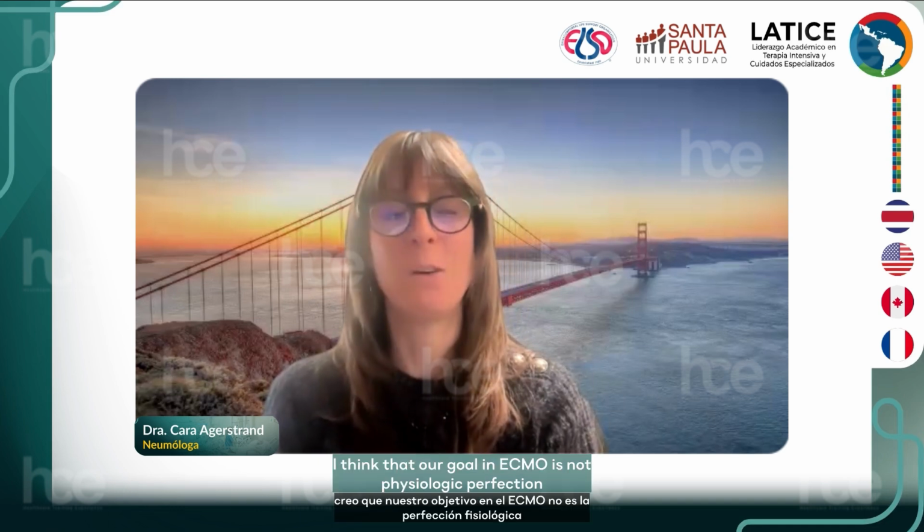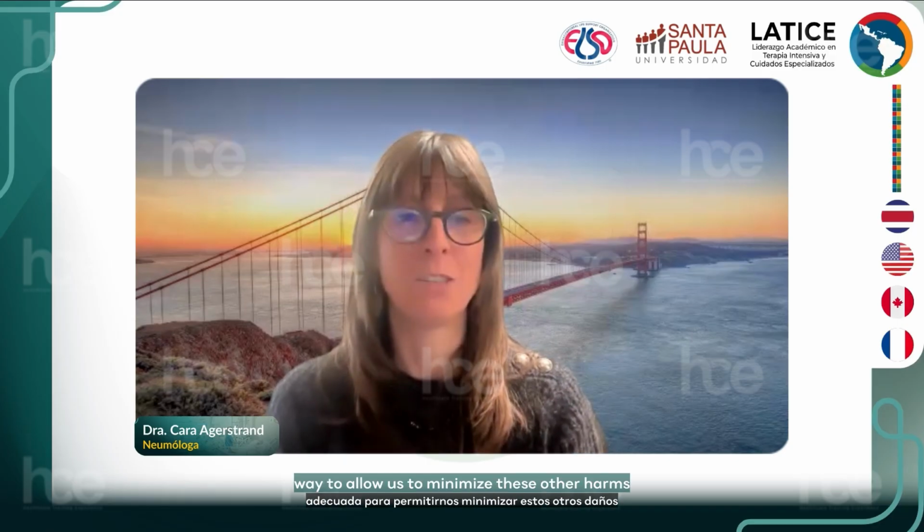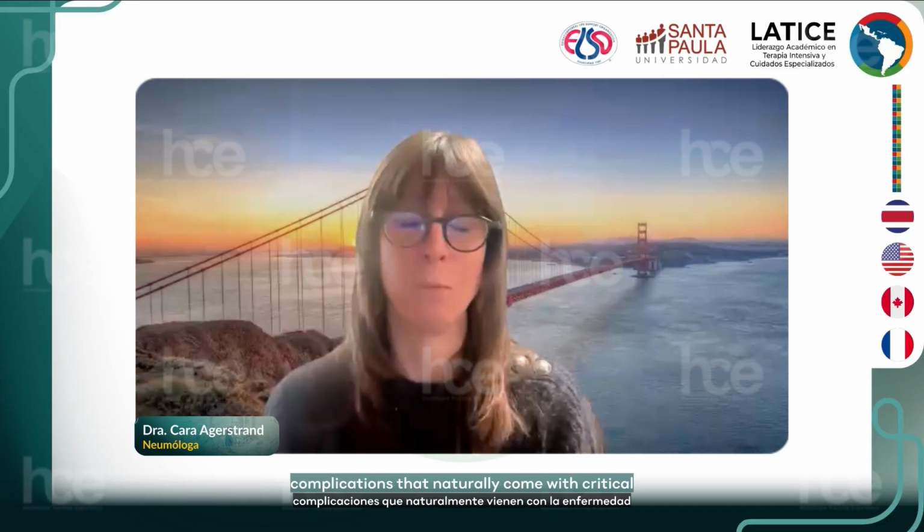I totally agree with both Eddie and Mathieu. And I think that our goal in ECMO is not physiologic perfection, it's physiologic adequacy. We want to support them in an adequate way to allow us to minimize these other harms, complications that naturally come with critical illness and ICU care, and even in non-ECMO patients, like sedation, et cetera.